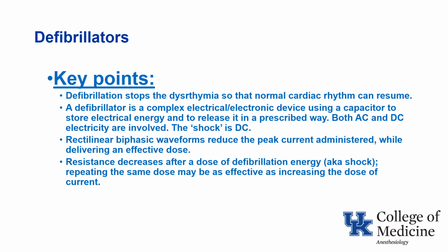Rectilinear biphasic waveforms reduce the peak current administered while delivering an effective dose, and this is one of the selling points of the Zoll defibrillator that we have. Resistance decreases after a dose of defibrillation energy or a shock, and therefore repeating the same dose may be as effective as increasing the dose of current.